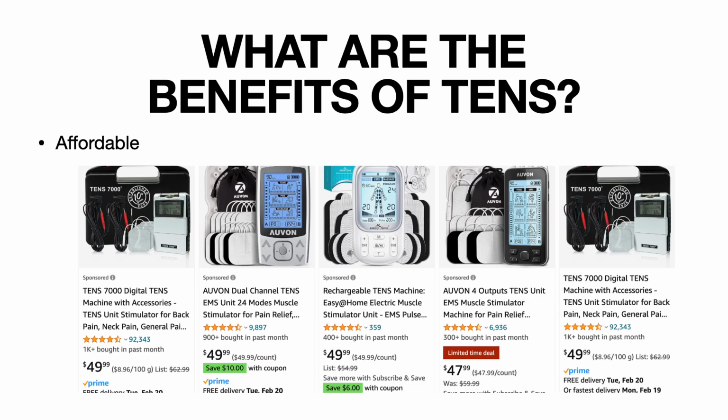So again, it's quite evidence-based, but another benefit is that it can reduce spasticity in an affordable way. So this is a quick search that I did on Amazon.ca, took a snapshot of the search, and you can see of these devices, all of them are under $50 Canadian. So if you compare this to medications or private sessions of physiotherapy or toxin therapy, it can be quite affordable.